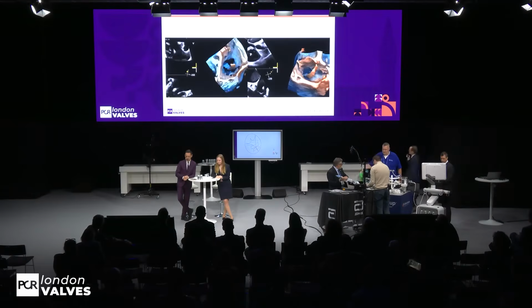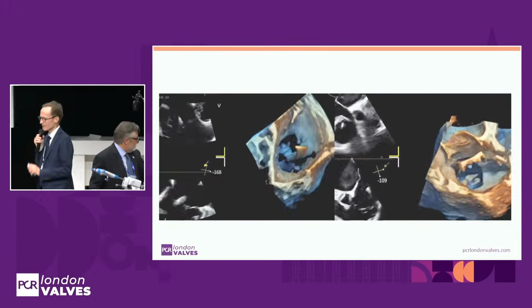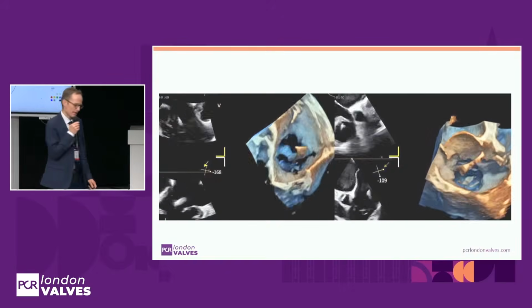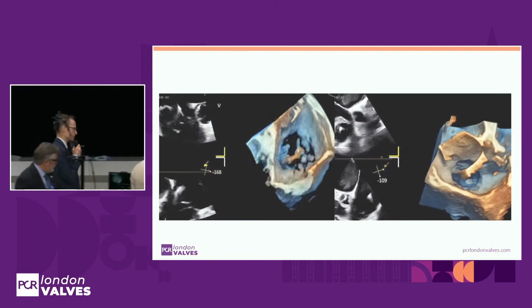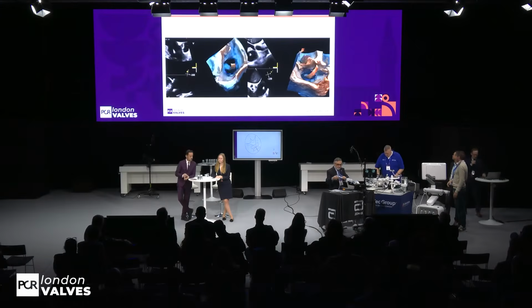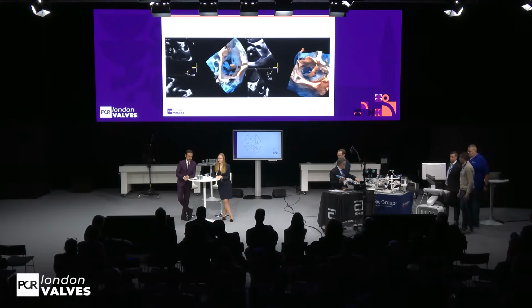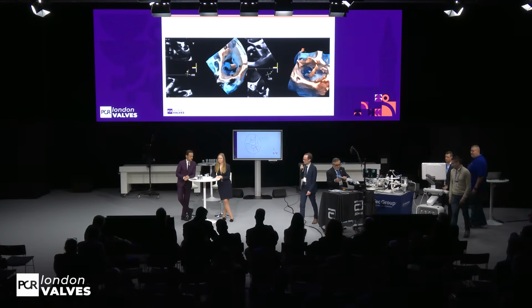So we can move on to the TOE, and you see that the lead is moving, so there is no attachment between the lead and the leaflets, and the lead is right in the middle of the valve. Then the question is, should we treat this patient with a TEER, or should we try to extract the lead, because this is an option.